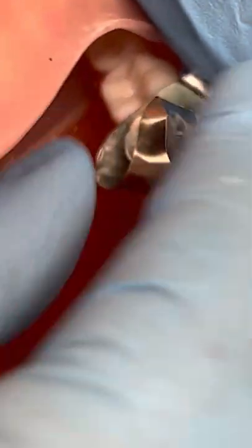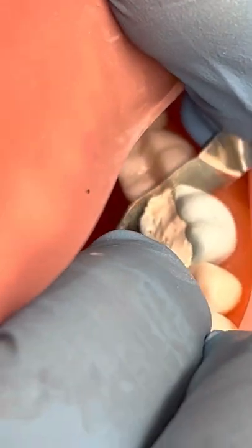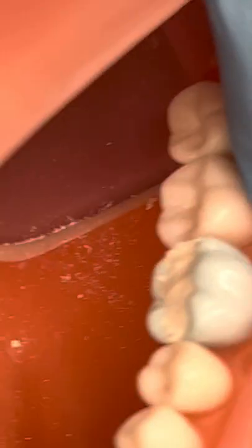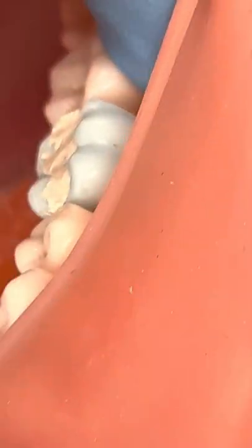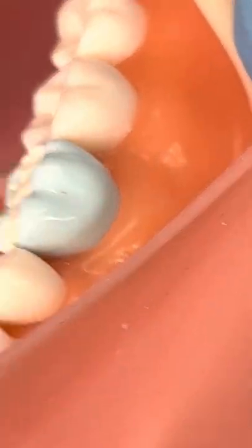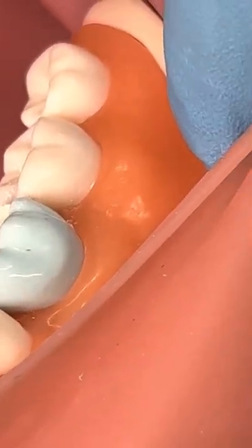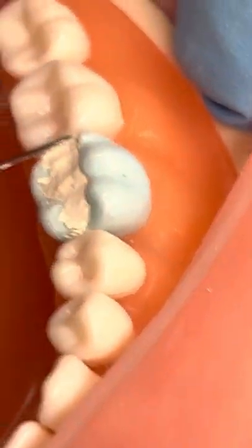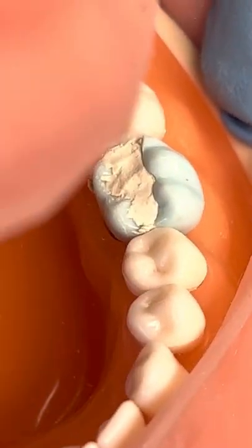She's going to kind of see-saw it out of there — make sure we come out easy. The goal there is to have contact for the contact space but not a big gap, so let's look over there — looks pretty good. And you don't want to floss it because you don't want to pop it out, but you usually can visually see.